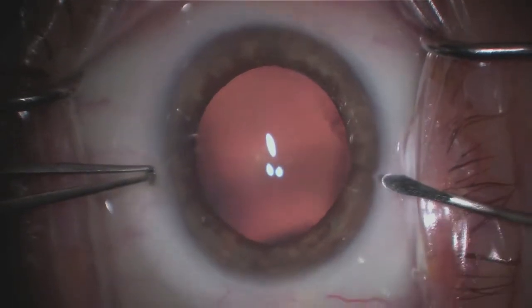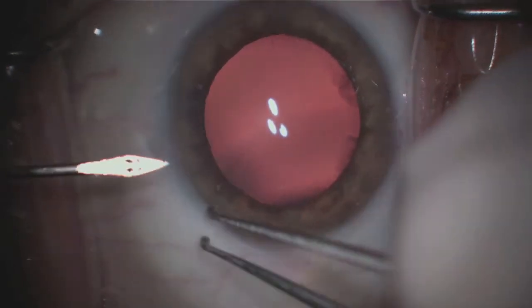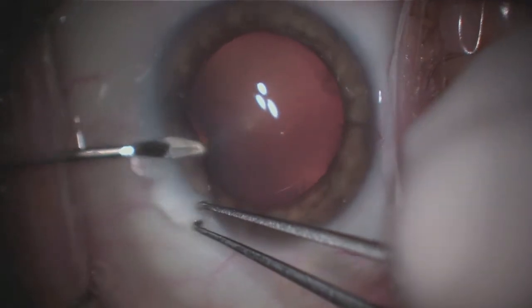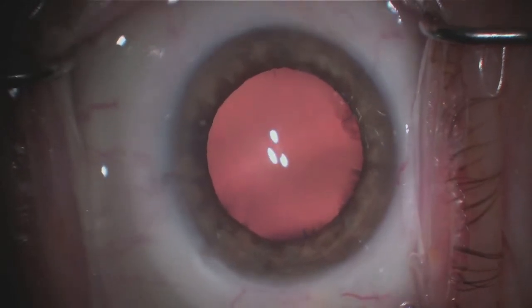Hello, my name is Rob Melendez, and today I'll be showing you a routine cataract surgery. A cataract is where the lens in the eye is cloudy and results in a decrease in vision. As a result, we'll remove the cataract and replace it with a new lens.